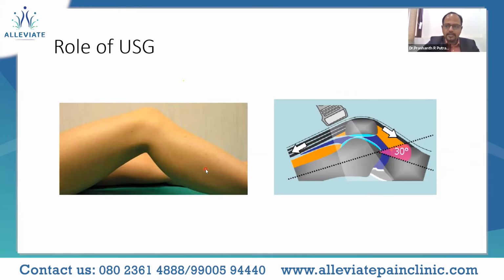Okay, so imagine this is the knee. The anterior aspect of the knee, the aspect where you want to scan, attains a very concave kind of position if you completely extend the knee. So we have to flex the knee 20 to 30 degrees to extend the extensor mechanism of the knee, so that we can see the structures properly, because the most important aspect over here is anisotropy. We have to avoid anisotropy because it can lead to misdiagnosis or the wrong diagnosis in certain conditions.